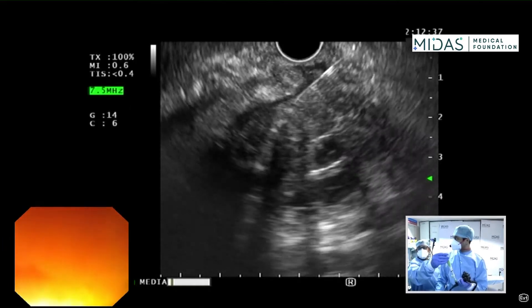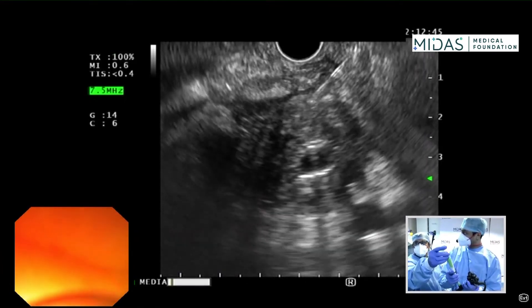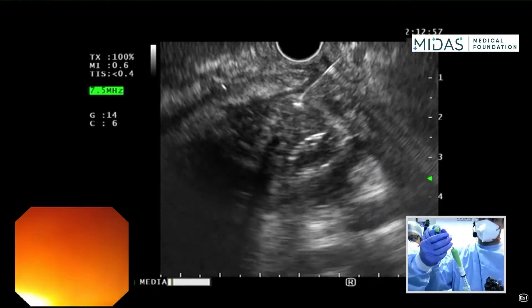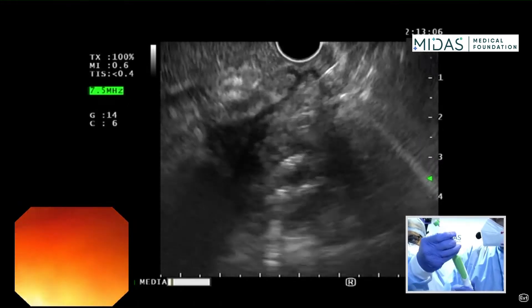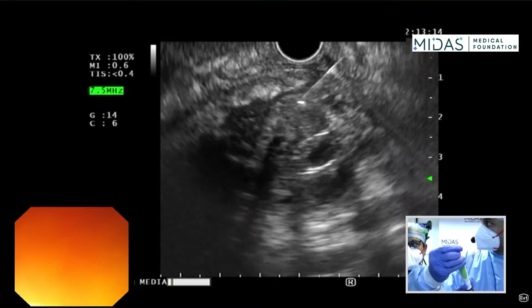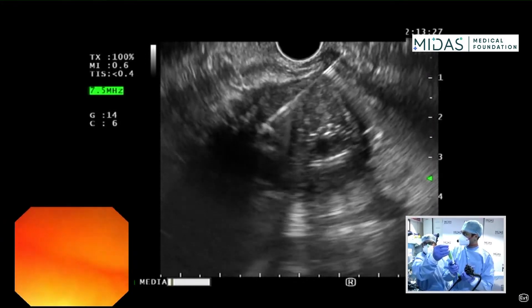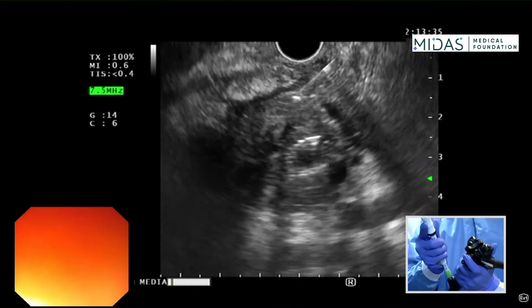In this case I have to use the elevator. I'm going to push it again and pull back gently using the fanning technique. What's important to demonstrate is that our technician is going to pull the stylet out as I'm pushing the needle in. I pull back the needle — what this does is create a slight negative suction, allowing material to come inside. I'll do it again. It's a hard mass. I'm going to use the elevator again to pull it back a little bit.